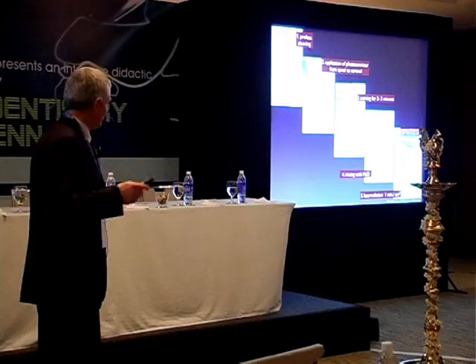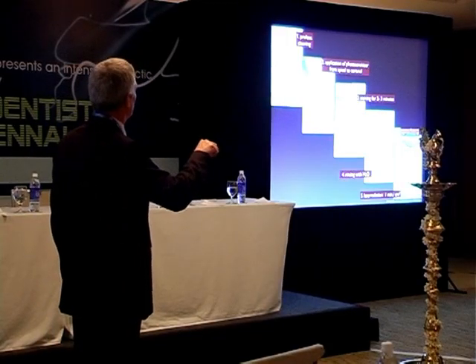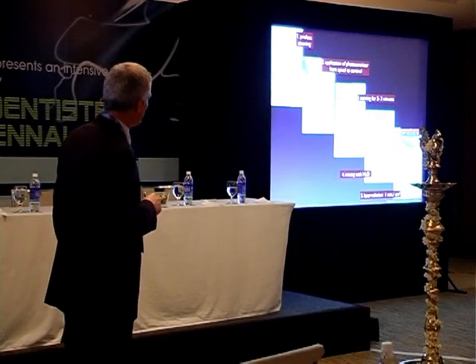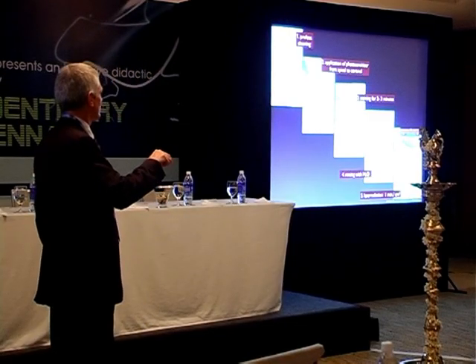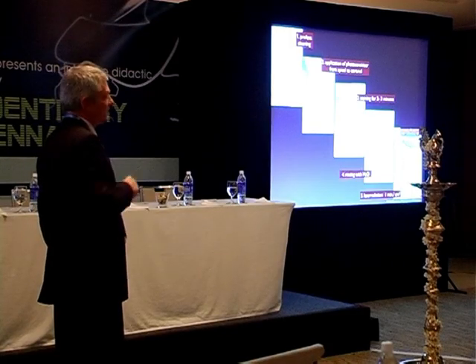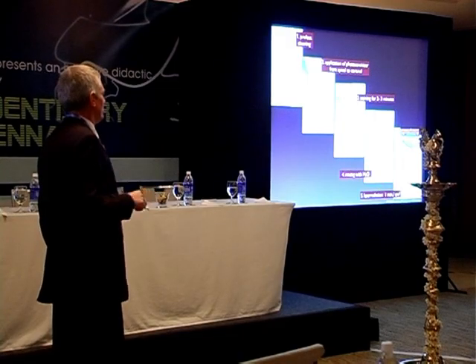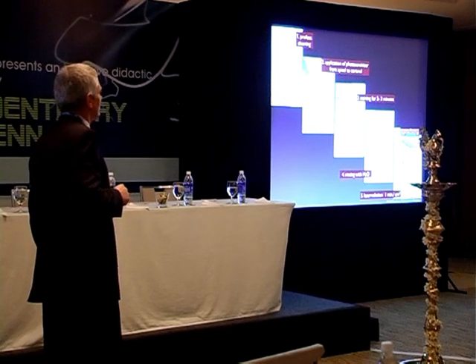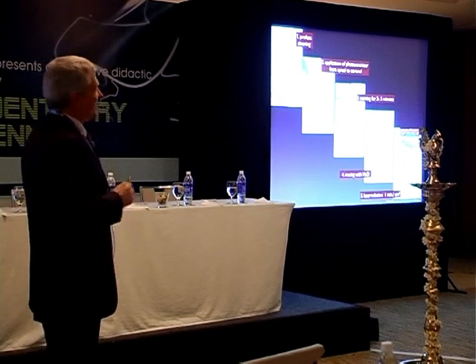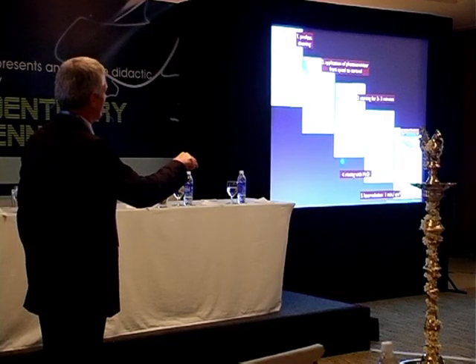So how does it work? If you want to use it in periodontology, first of all you do a professional cleaning of the pocket. After that you apply the photosensitizer from apical to coronal, staining for 2 or 3 minutes. After that rinsing with water, and after that laser irradiation for 1 minute per square centimeter. What is happening? You are staining the bacteria.